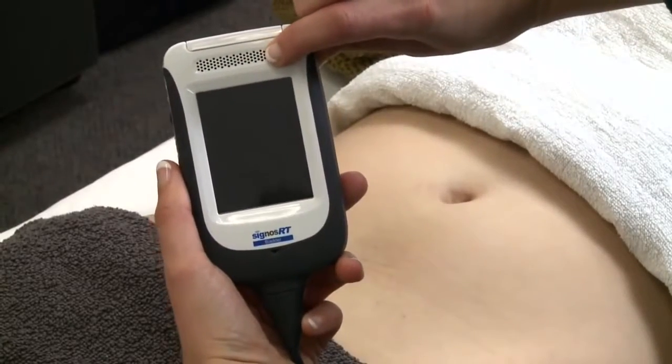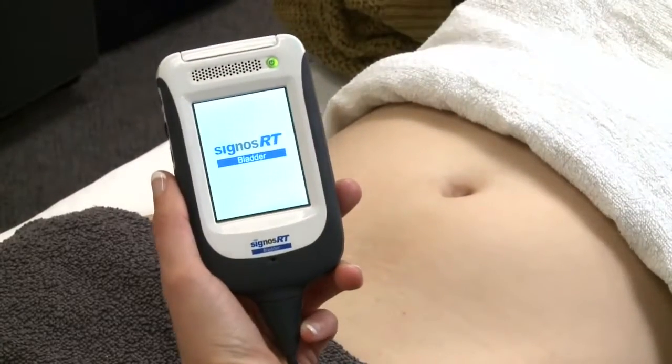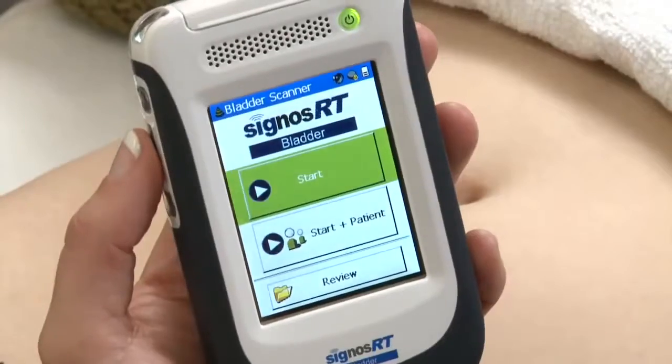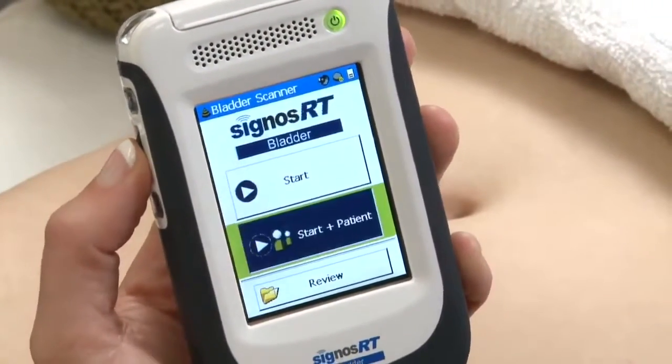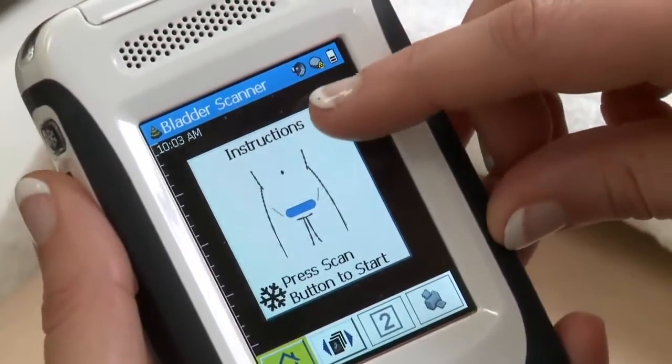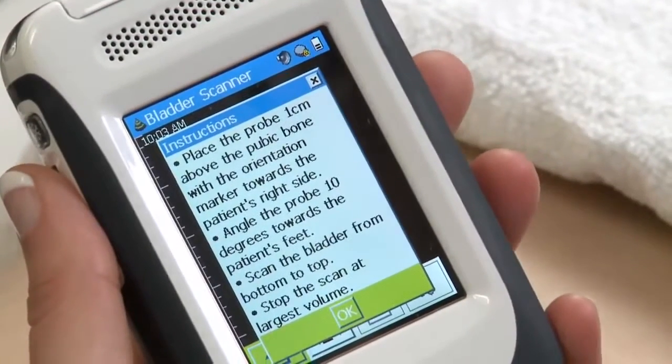Turn on the bladder scanner and you're ready to scan. Selecting start allows you to scan immediately, or select start plus patient if you wish to enter patient details. The picture icon and help button will guide you on probe position.